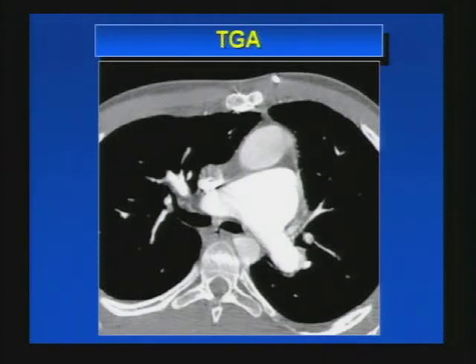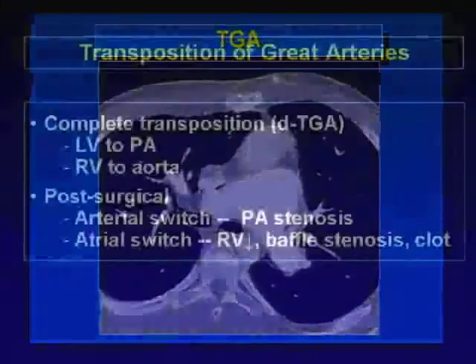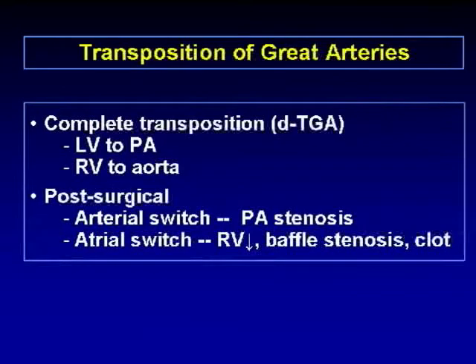This axial CT demonstrates d-transposition of the great arteries — the aorta is anterior and to the right of the pulmonary artery, typically seen with complete transposition. In complete transposition, the left ventricle connects to the pulmonary artery and the right ventricle connects to the aorta.